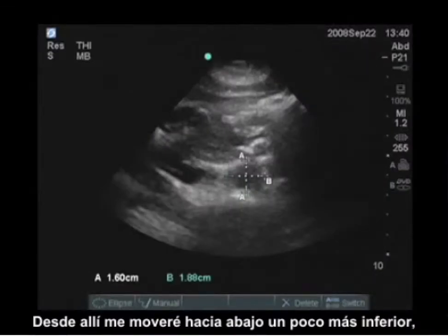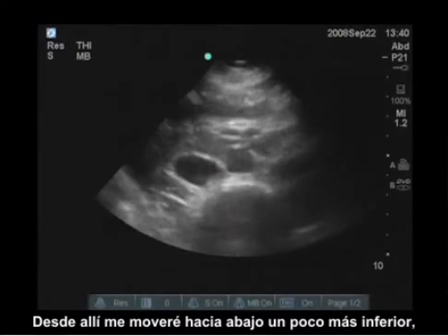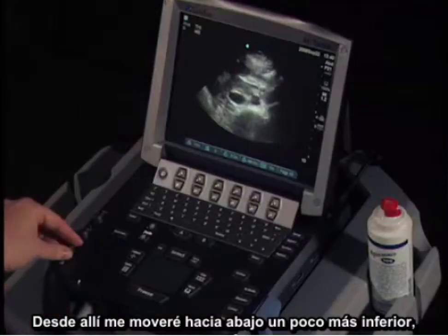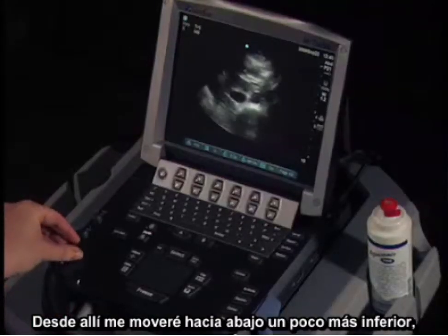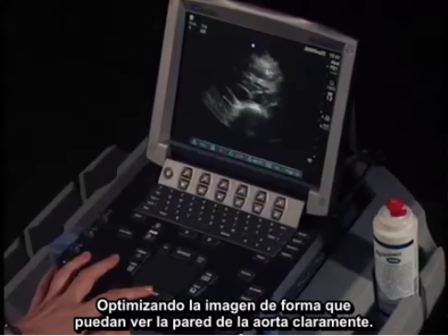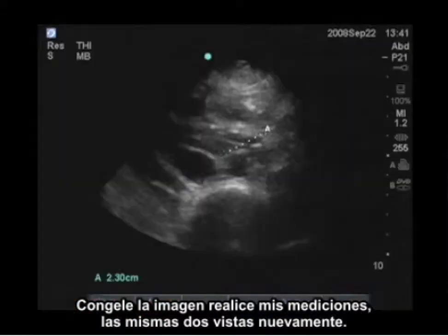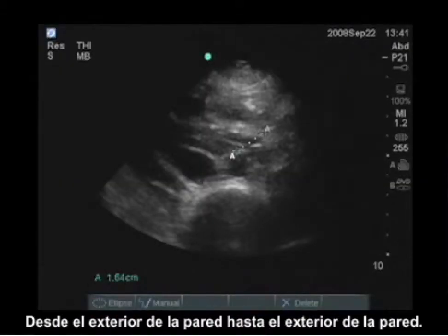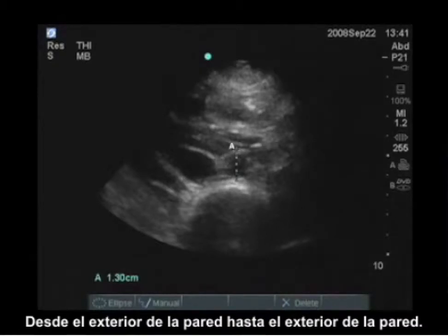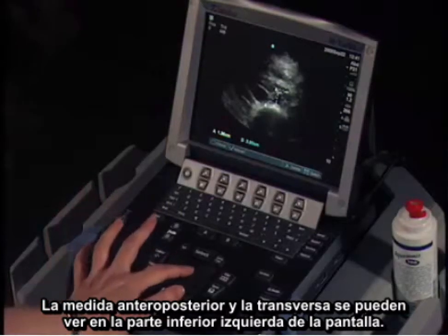From there, I'm going to move down a little bit more inferior, optimizing the image so I can see the wall of the aorta clearly. I will freeze the image and perform my measurements — the same two views again, from outside wall to the outside wall. That's the AP measurement and the same with the transverse.